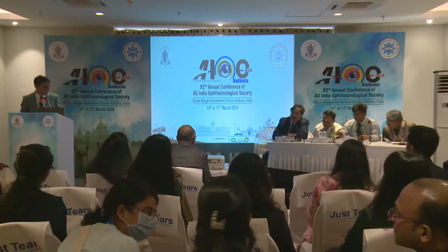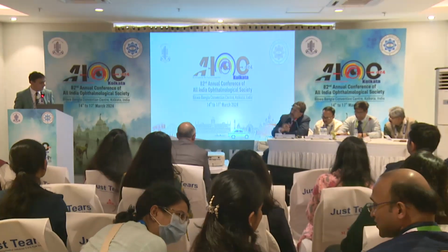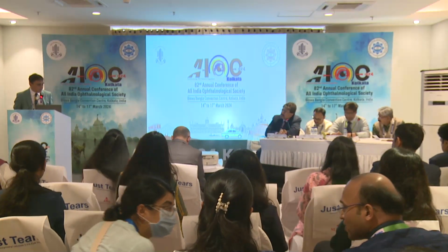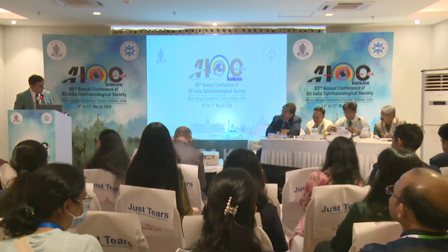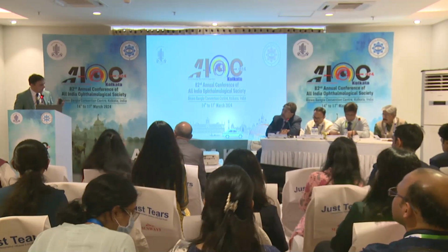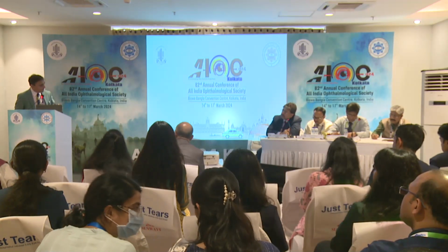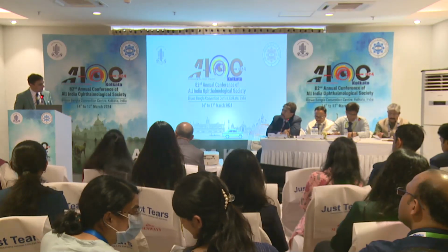One is that if you have an IOL tilt, like a subluxated lens, the femto compensates for the depth difference in terms of your doing the rhexis. So there are two advantages there. One is you can move your rhexis in any direction you want, XY. Two, you can have any size. And three is the only scenario where you can do a fragmentation of the lens in the area of subluxation. So you can do a fragmentation which softens your nucleus before you even start your phacoemulsification in the area of the subluxation, which is not possible in any other scenario.